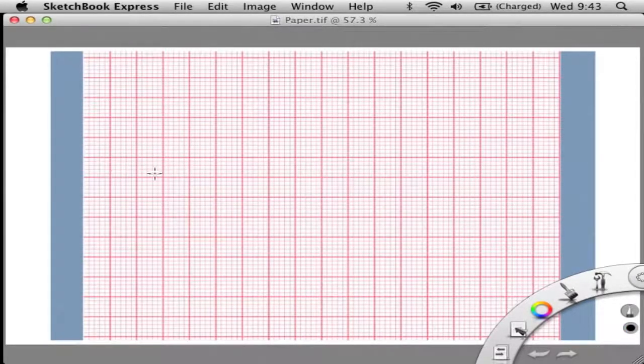So maybe it looks something like this. I don't know. We're going to try. I haven't tried writing on this paper yet, so let's try. So we go along, and we've got our P wave here, and then we go something like this. Maybe not like that, because that's not a good drawing. Anybody try drawing not looking at paper? It's not the easiest thing. A lot of artifact in that. It's okay, my hand jiggled. All right, so let's try one more time. So P wave, no Q wave, goes right into your R, S, back to your isoelectric line, and then your T wave. All right, that's much better.